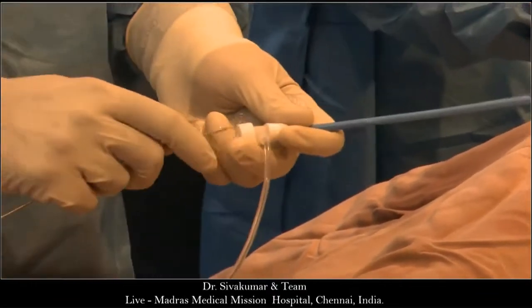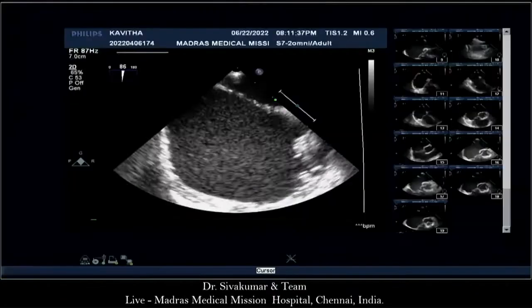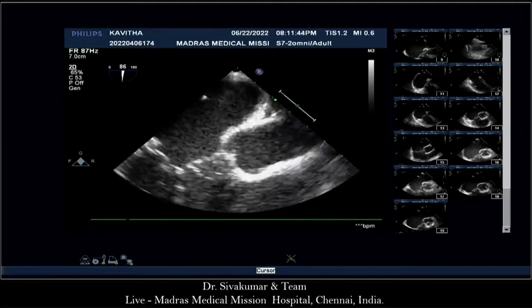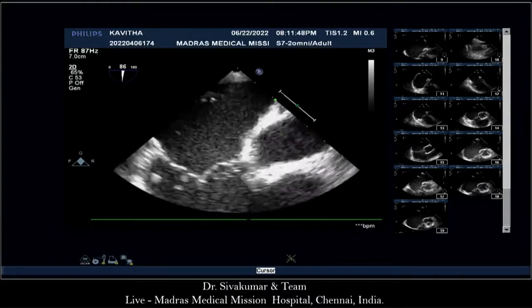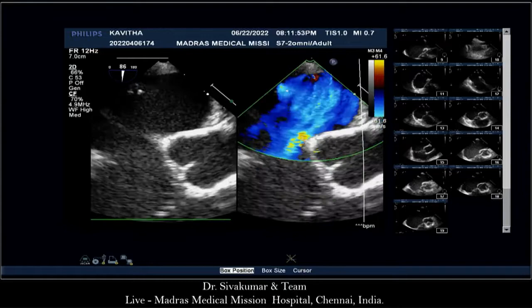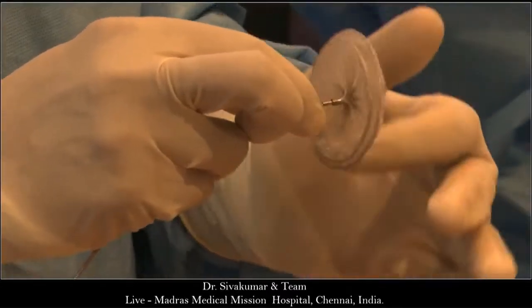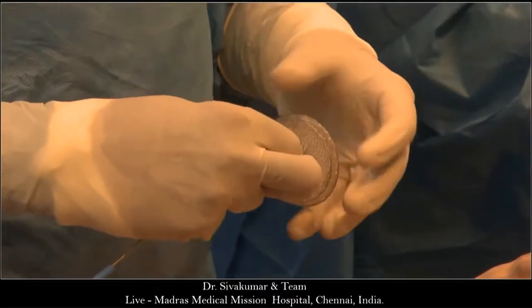What is a bicaval view? On a left, show the echo. What's the diameter in bicaval? I'm exposing the ASD only when I'm rotating leftward now. So that's not bicaval. It's 0 on the bicaval. We can't measure it. We can't see it. How can we measure it? Whatever she sees, right? So you see IVC, right? Show the echo. So we're not going to get the answer so far.